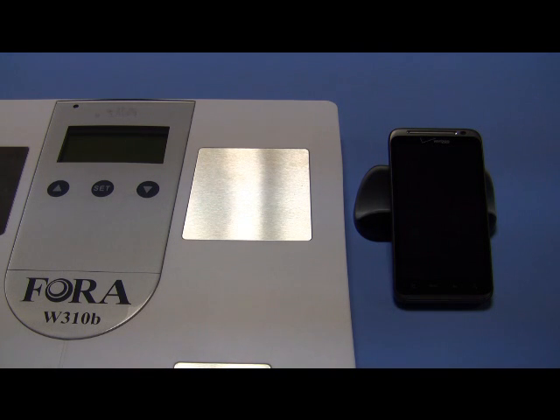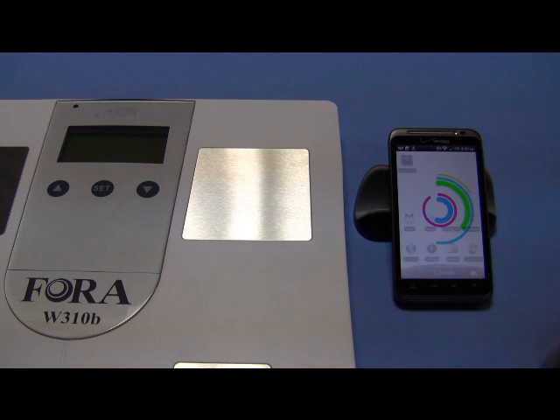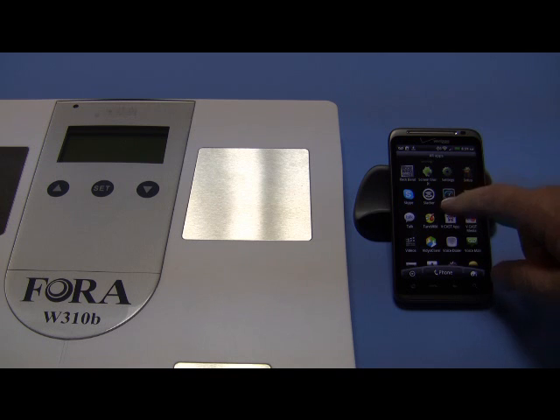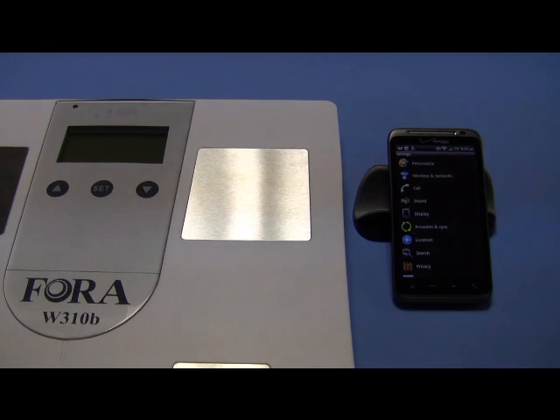Meg, this is a custom-made video for you — nothing fancy, but just to show you how to set up and pair the phone and the scale. So you turn your phone on and unlock the screen, go into your applications and find Settings. You see Settings right there — open Settings.